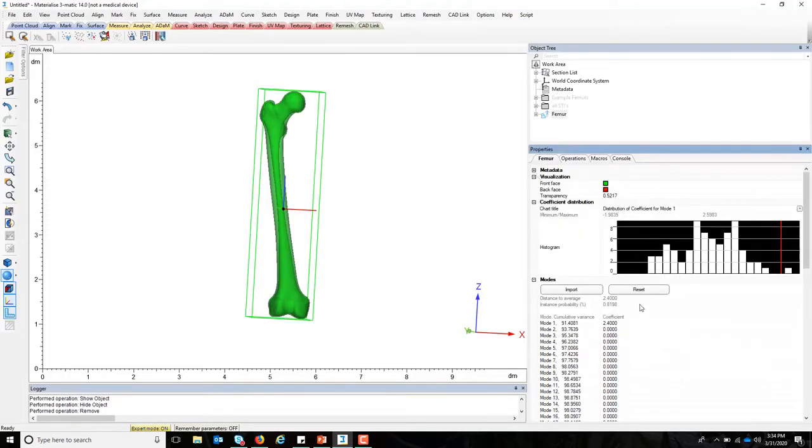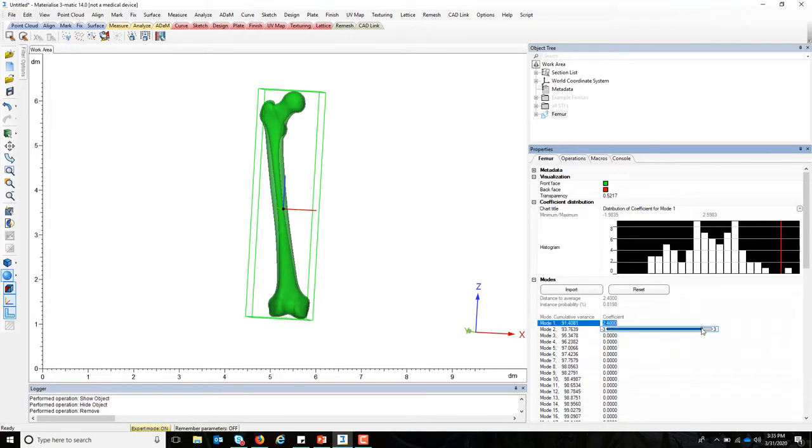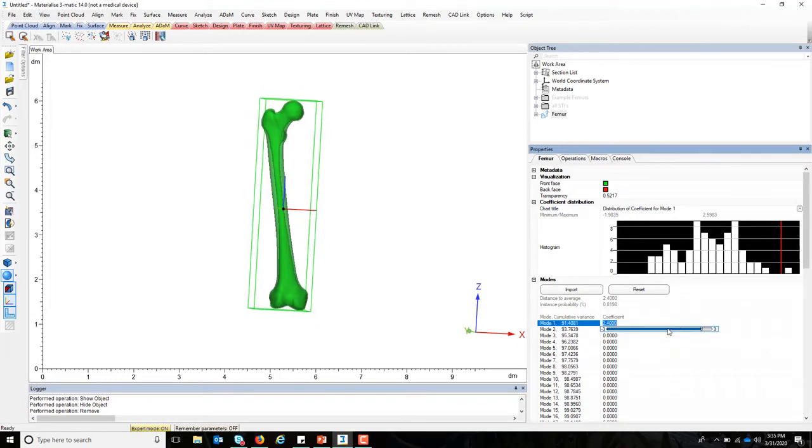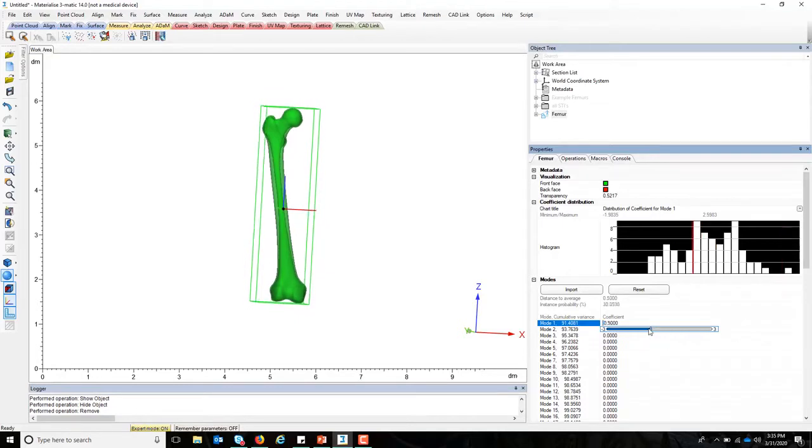If you look towards the bottom and the different modes, what you'll start to see in each mode is a shape changer. And what I mean by that is, for example, in mode 1, if we move our slider across left to right, think of this as moving along that bell curve that you saw in the image before.